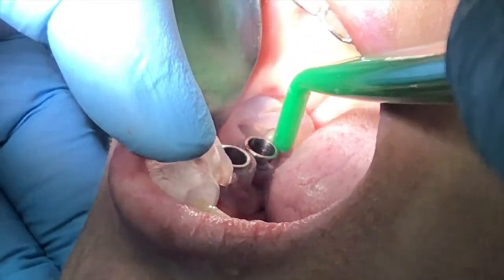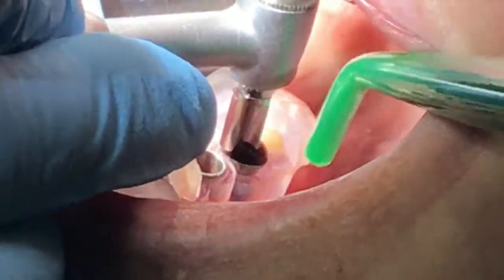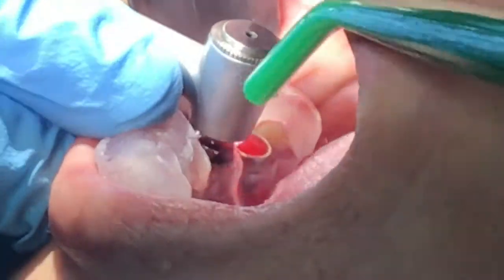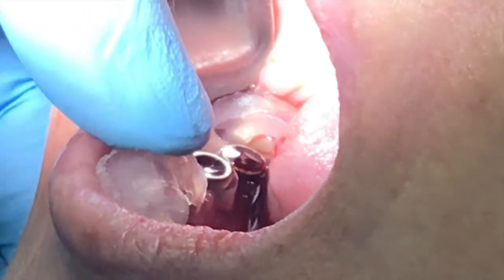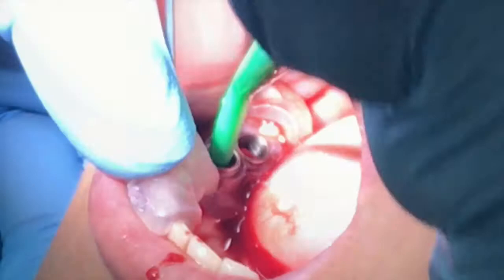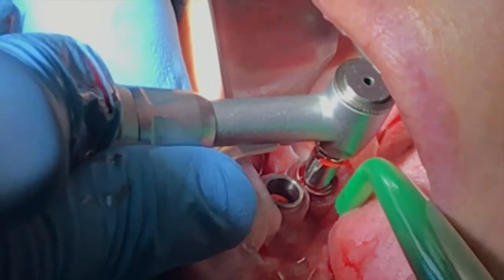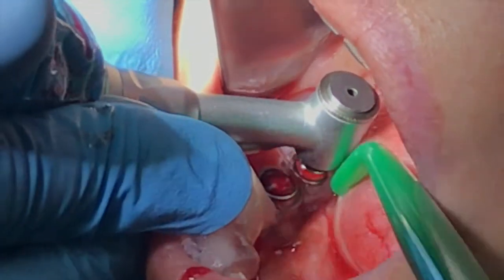What we are doing here is drilling with the pilots using the crown-down technique. In other words, we start with the pilot at 6, then at 8, then at 10, and then at the final working length, which is 11.5 in this case. We have completed the pilot drills and now we are going under 2.5. Again, we start with 2.5 by 6, 8, 10, and 11.5.